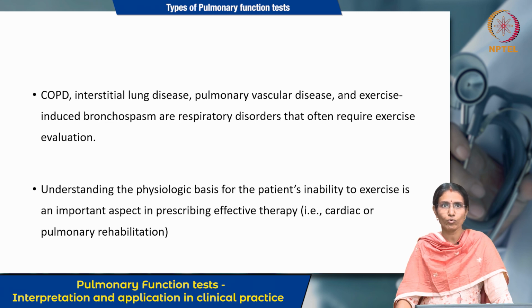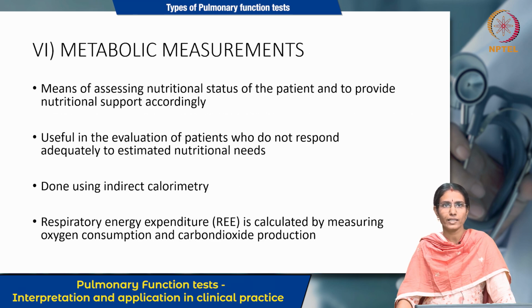And why do we have to do these tests? Any exercise evaluation will help us distinguish between a cardiac or a pulmonary cause of the patient's inability to exercise, and hence therapy can also be started accordingly. Either a cardiac rehabilitation or a pulmonary rehabilitation can be started. So these are the uses of these cardiopulmonary exercise tests.